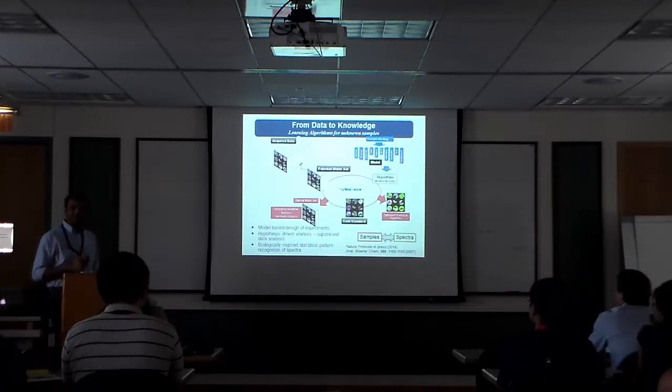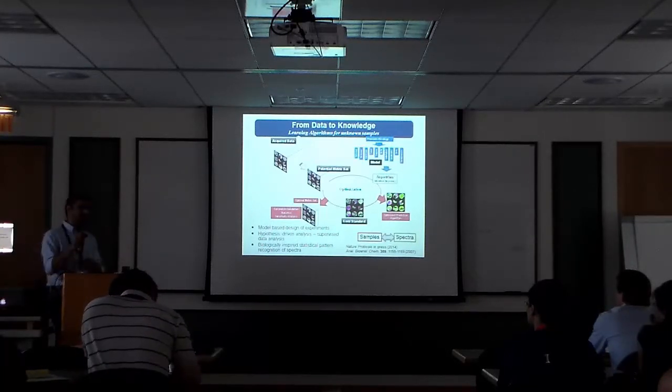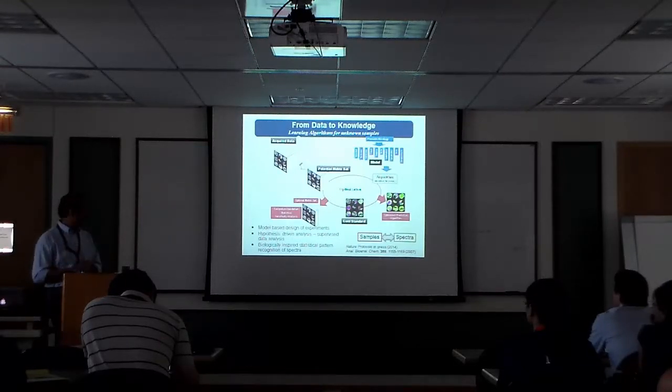Okay. At the end of it, then we try to break it. We try to go back. We say, what if we removed this thing, like building a little Jenga piece? We start removing things off and on. And as soon as the structure falls down, then we say, well, this was perhaps crucial for this. And then we go back and repeat this all over again. We repeat it for pairs. We repeat it for things. So there's a fairly involved computational method here.